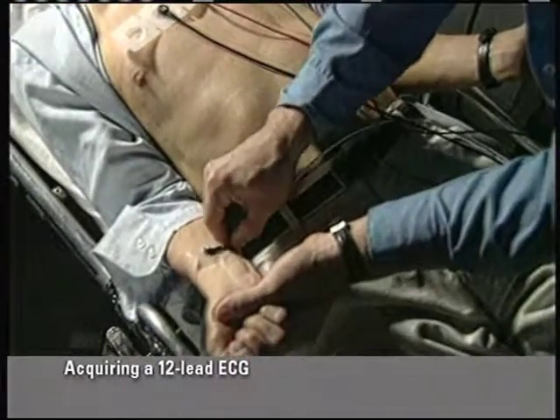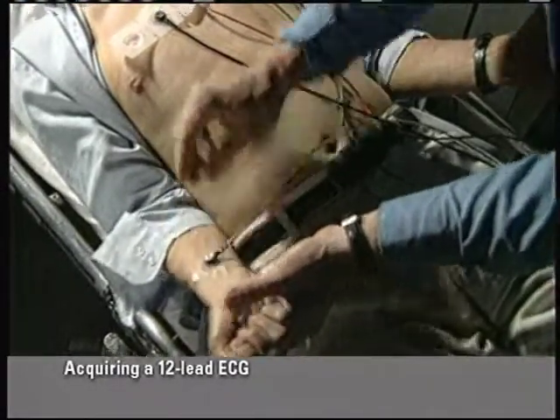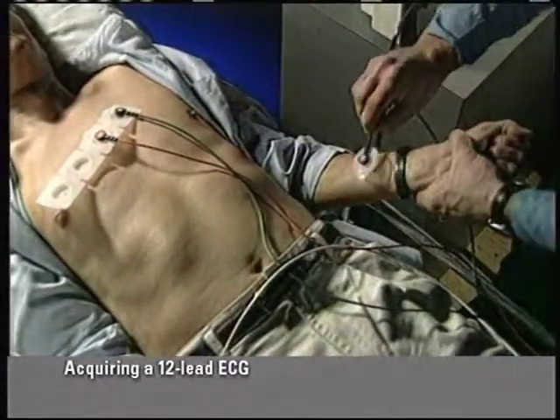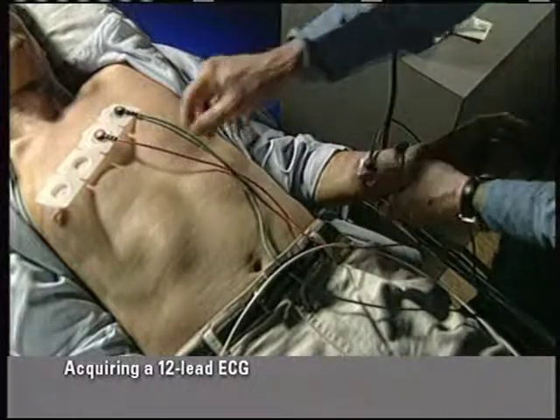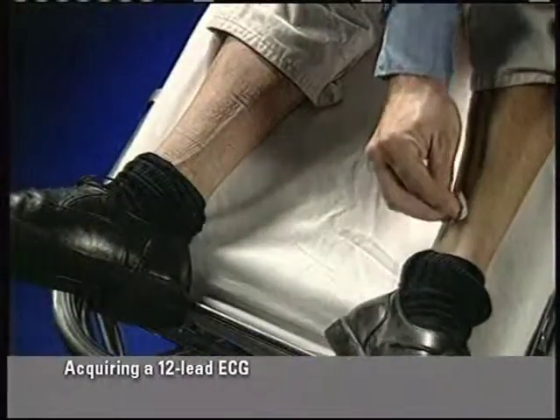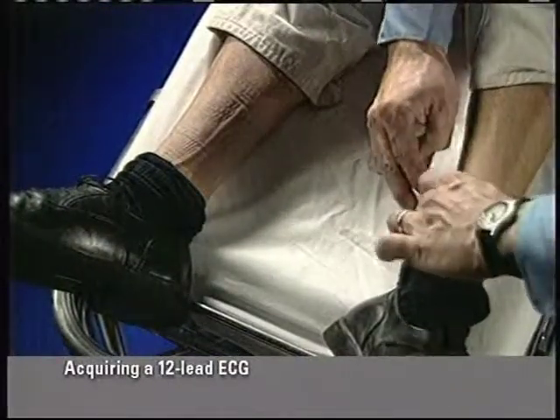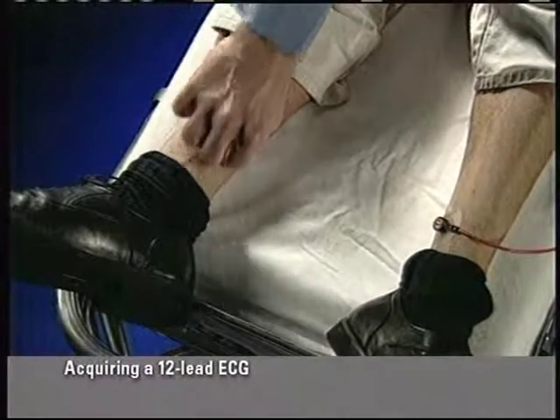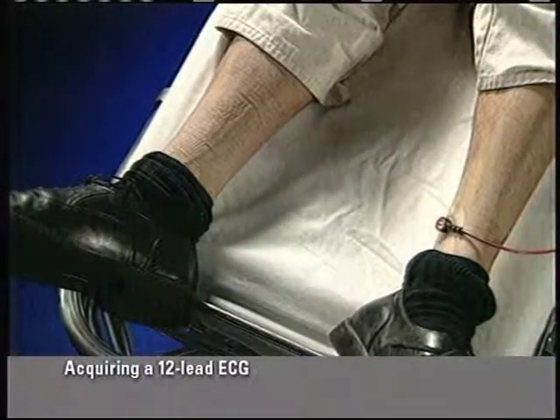Place the right arm electrode near the wrist on the inside of the patient's right arm. Place the left arm electrode near the wrist on the inside of the left arm. Place the left leg electrode on the inner aspect of the left leg near the ankle, and place the right leg electrode near the ankle on the inner aspect of the right leg.